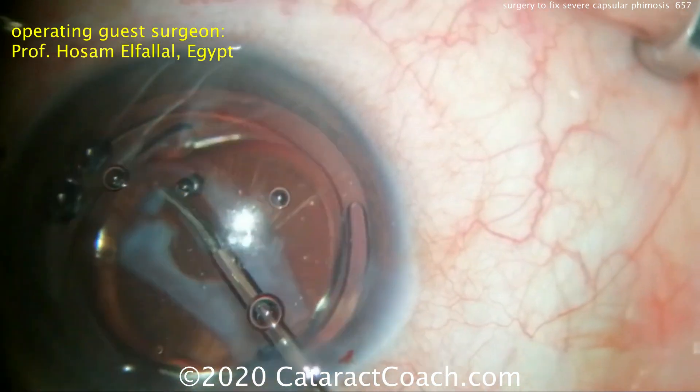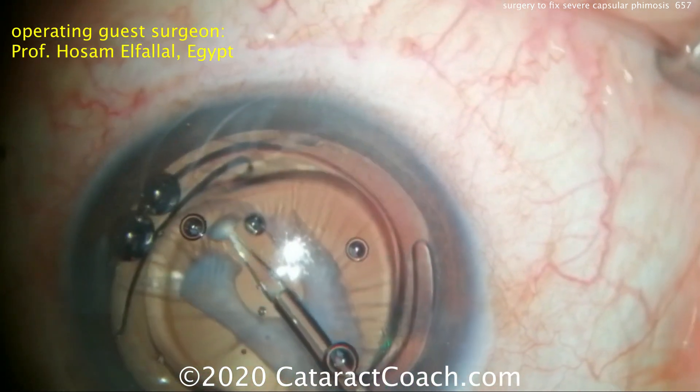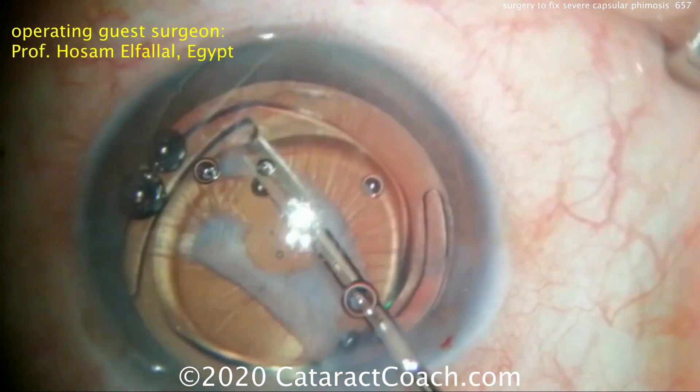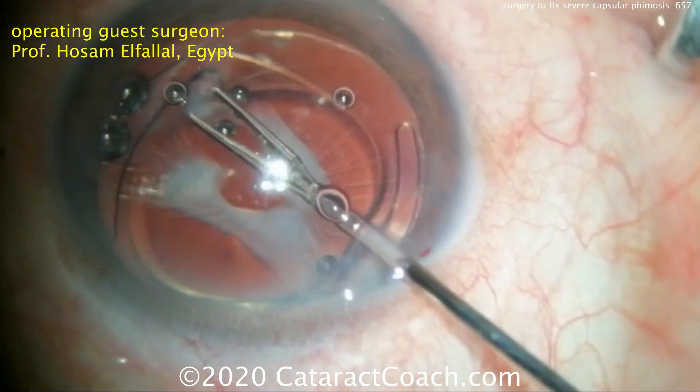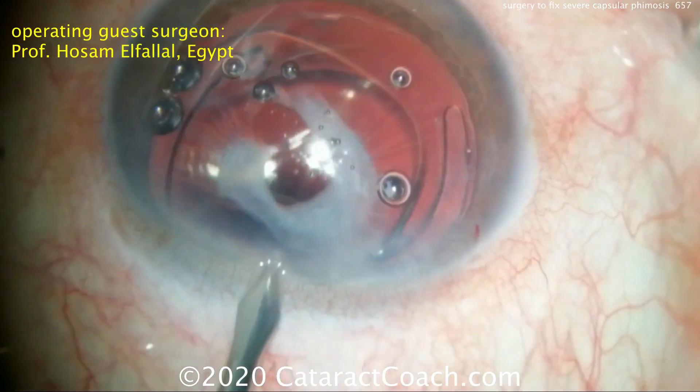You can use another paracentesis — even two more paracenteses — to make more access to the rest of the capsular rim. You can see that one piece of tissue has been cut out, grabbed with forceps, and removed from the eye. Good progress is being made.